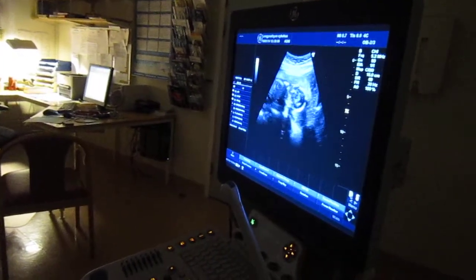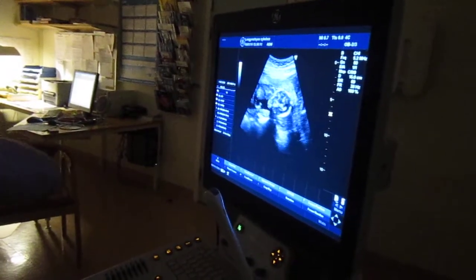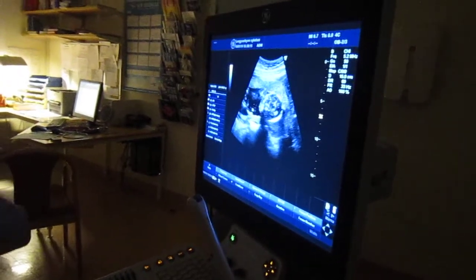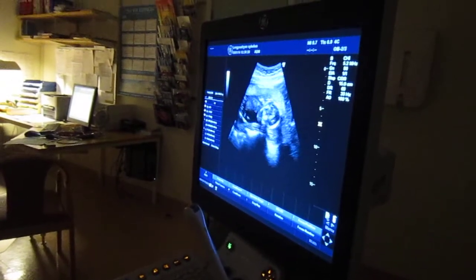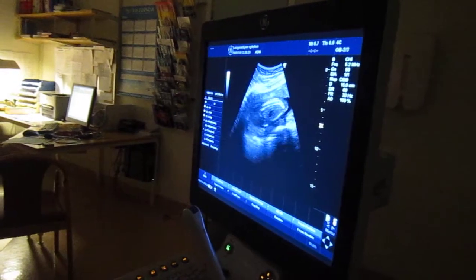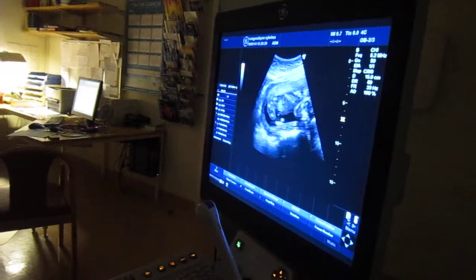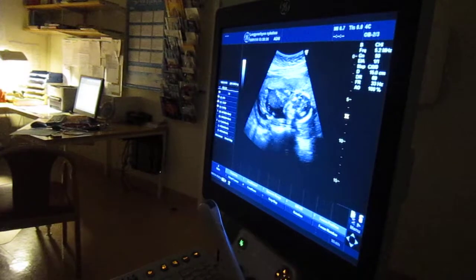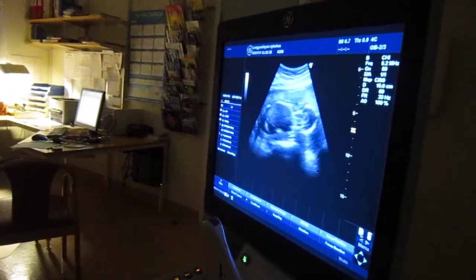So we see exactly what is under this, like a coffee filter, you know? So I have to move it to the sides or turn it 90 degrees to have a good view of the baby. And that's why I have to move it like this all the time. The first thing we look at is: is there really a baby here or not? And is it more than one? And is it inside the uterus? That's a very important thing to know, of course. And we can say, yes, there is one baby and it's inside the uterus.